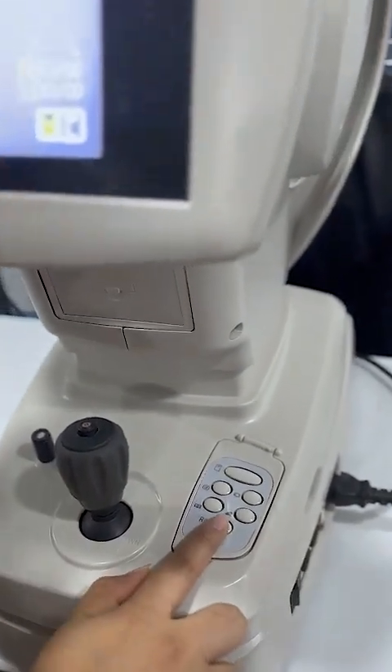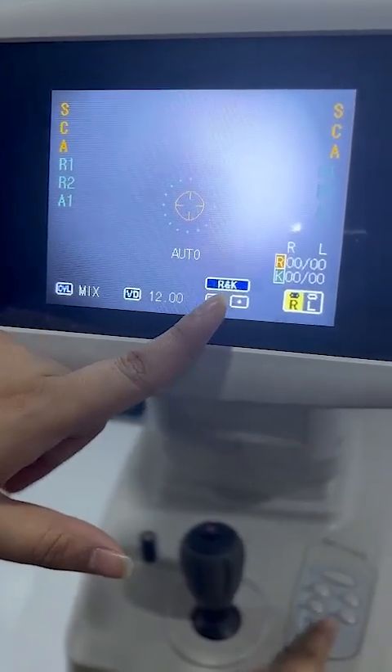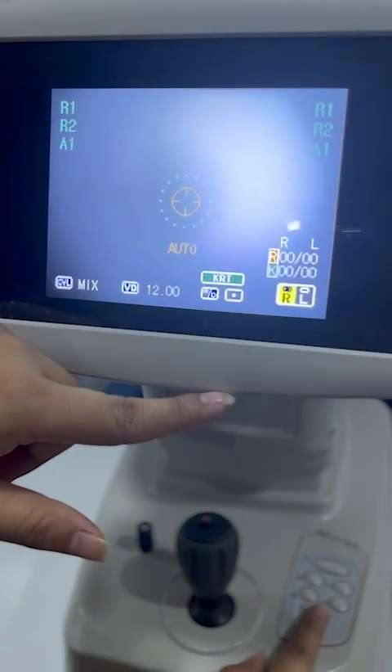This is the mode setting — it is set to R and K, meaning both refractometer and keratometer. But you can select only refractometer, or only keratometer.